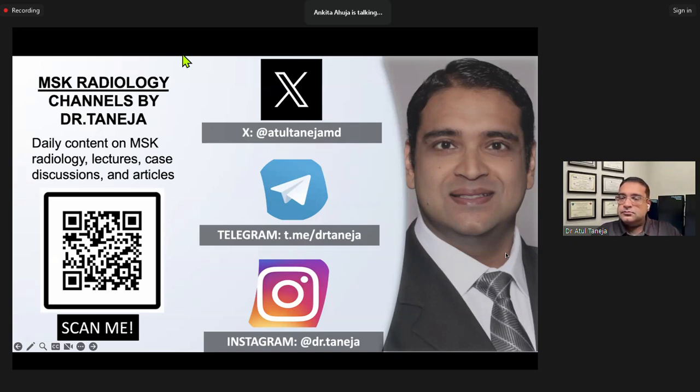Then the next question is, can you tell us about the 3D sequence? Yeah, sure. We use 3D sequences in all joints, shoulder, elbow, knee, all the bigger joints. We have a 3D in all our protocols when it's an orthopedic protocol, meaning joint derangement. We do 0.7, 0.8 millimeter slices, isotropic acquisition. Regarding which sequence, we usually do either SPACE fat suppressed or FSPGR, depending on the scanner.